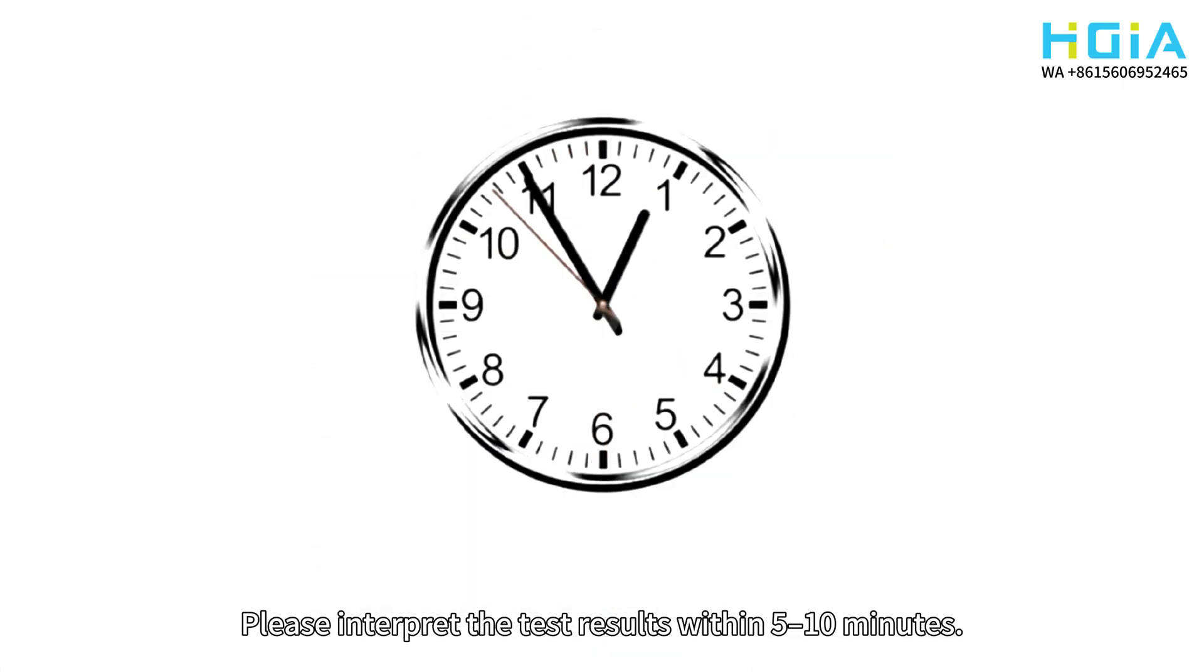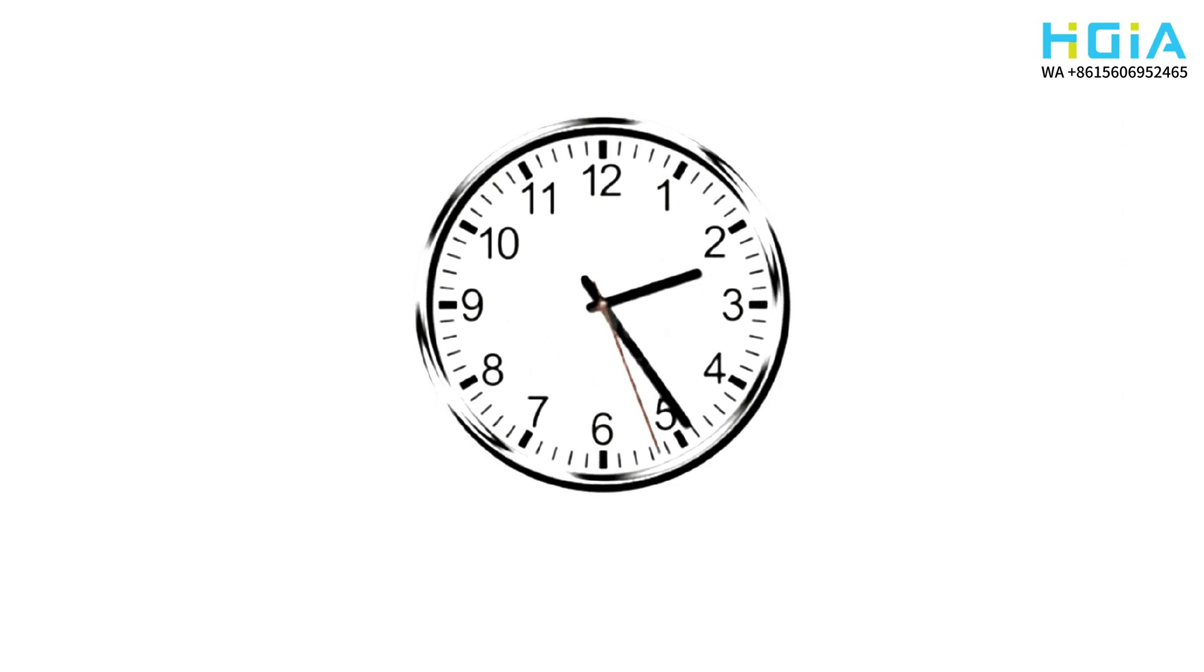Please interpret the test results within 5 to 10 minutes. Do not read the results after 15 minutes.